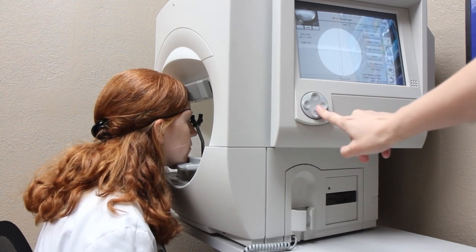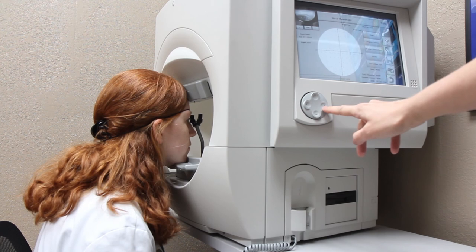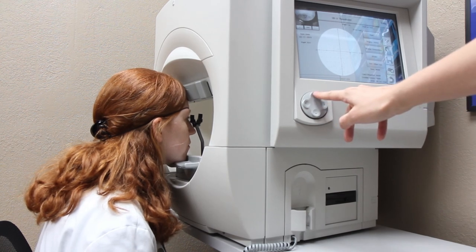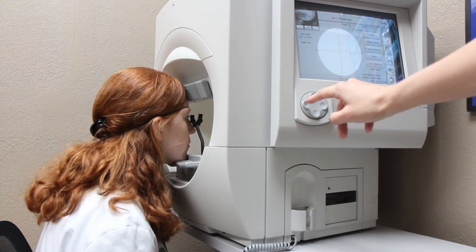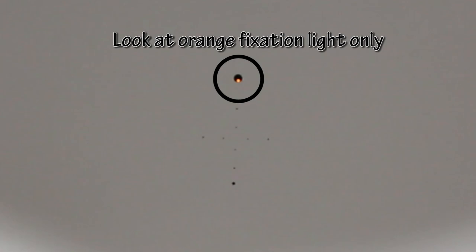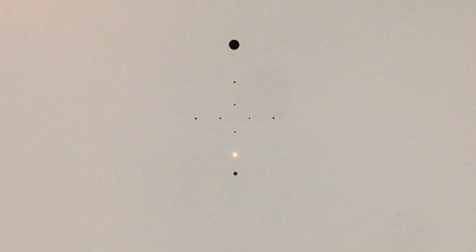The test takes 4-8 minutes per eye, so make sure you are comfortable before the test begins. During the test, you must always look at the center fixation light. The fixation light may change depending on the type of visual field you're taking.